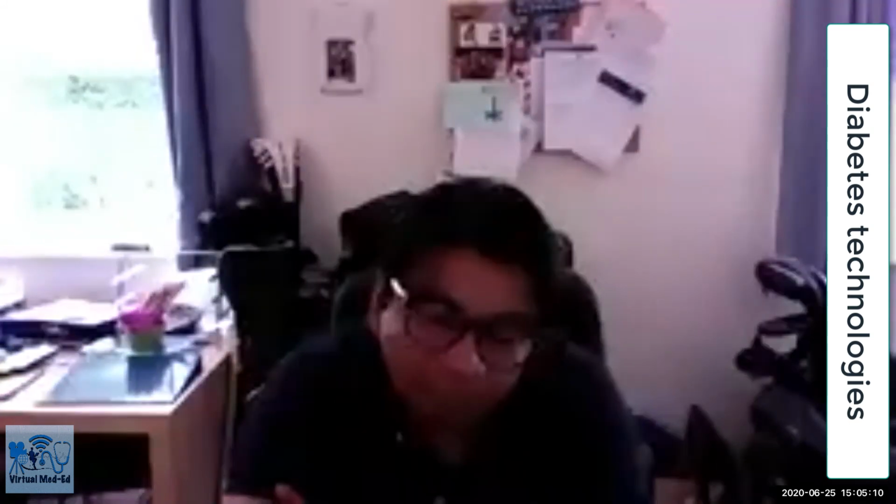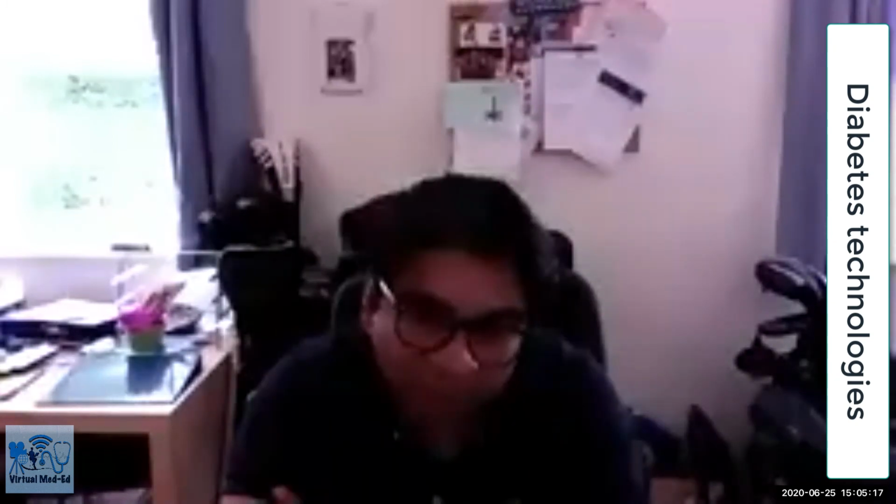But I've had 2 or 3 patients lately that I made a very quick decision, saying, let's just go with 670G. And what's interesting is, even before they go to auto mode, just in the manual mode for the first week, actually that's all they needed. They don't even need auto mode, you see. So they've got the insulin suspend feature, the 640G in the manual mode with the sensor in place. So they don't really need 670G. So I think it's the patients who tried their level best and despite that have significant variability, where they need real-time alteration in the basal insulin, who benefit from 670G.